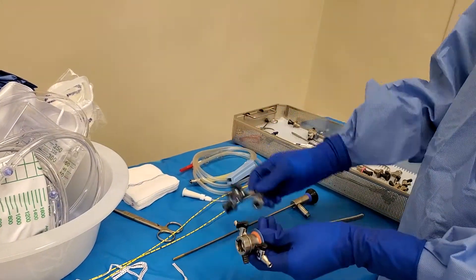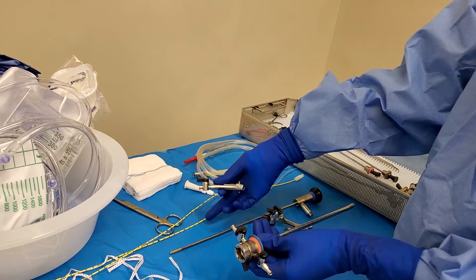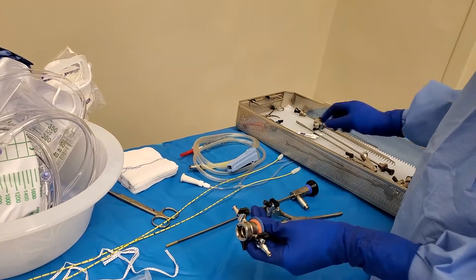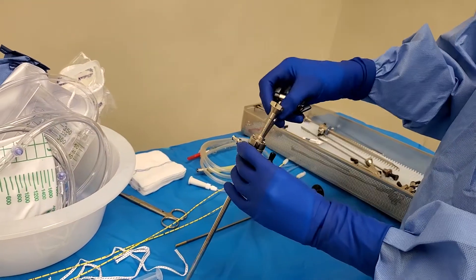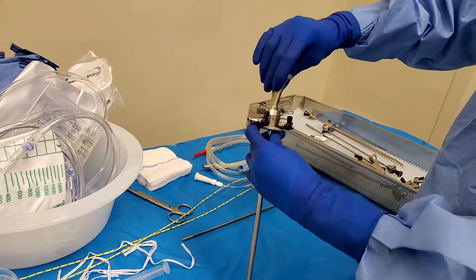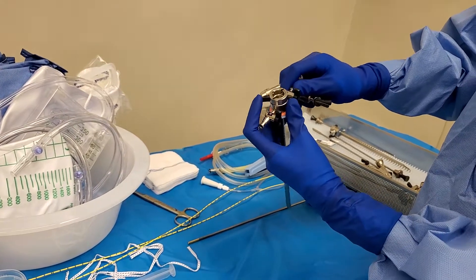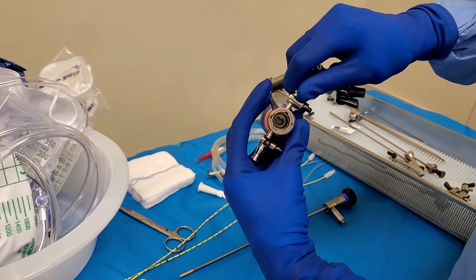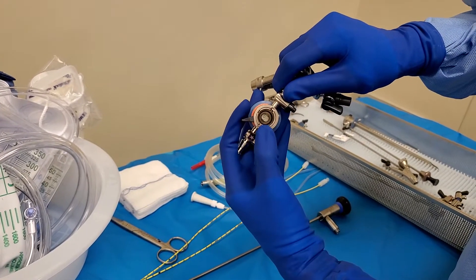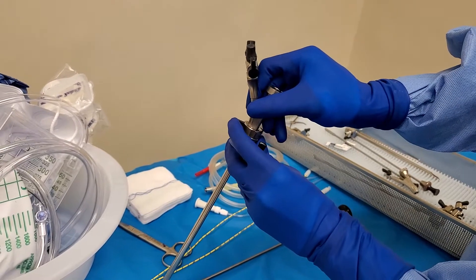This is called a double bridge. It's actually a one bridge, but since we're doing two ureters, we're going to use a double bridge. So these two come together — you kind of just have to play around with it. It's like a puzzle. This kind of rotates, and you see how that aligns with that to open it up? That's where you want to put this.